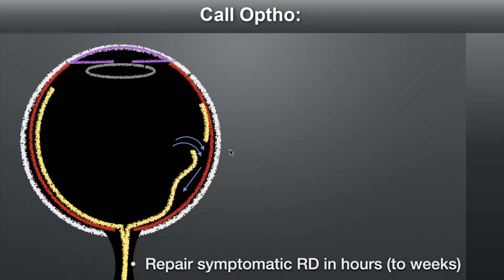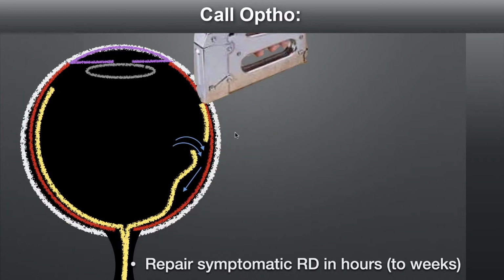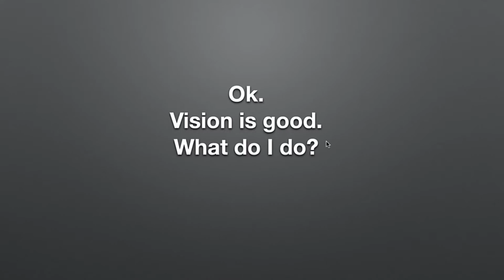So not all of these are emergencies that will go to the OR the same day, but most of them will be repaired within the next couple of weeks, depending on the patient's story. So hopefully I've convinced you that vision is a good thing and that this ultrasound is going to be useful for us. So let's talk about how to actually do it.